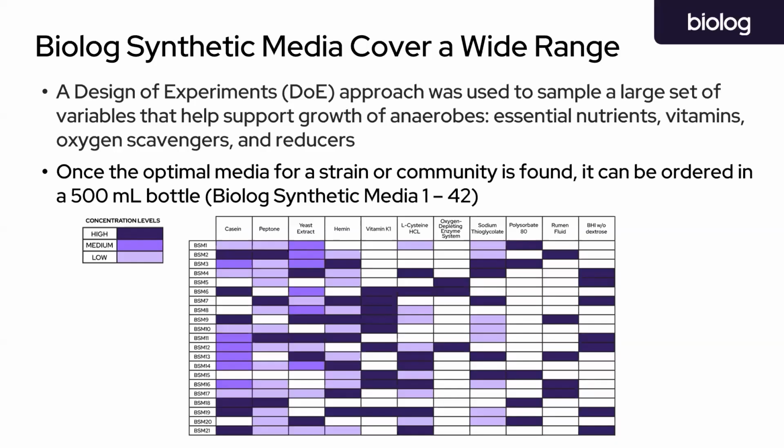That's another good question. Biolog synthetic media can enable growth for larger scale experiments, such as in shake flasks or small fermenters. And the cells from these experiments can be used for different omics, such as metabolomics, for example. They're very compatible.